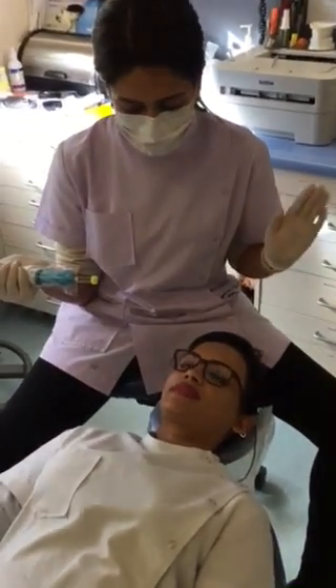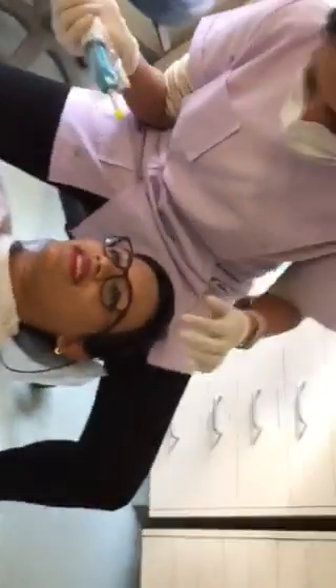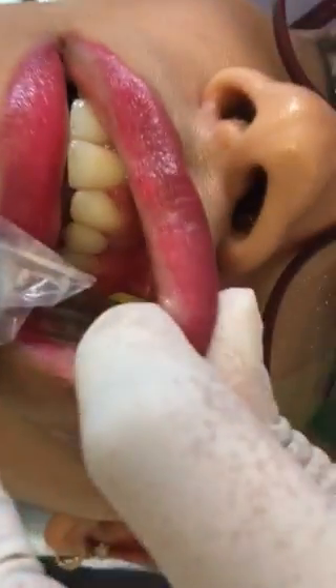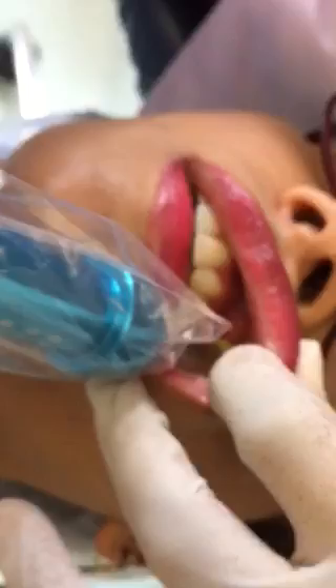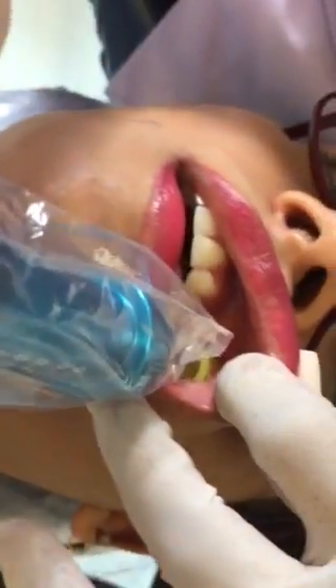Me and Dr. Chitra are performing an infiltration. Hi ladies, okay go for it. So you're performing on tooth number twenty-five. Just apply a bit of pressure. Is that okay with your patient? Yeah, aim it a bit away — just like where you put your normal syringe needle, a bit away, meaning exactly where you put your needle. Yeah, there. Okay, is my phone in your way? Can you see what you're doing? Yeah, I can see what I'm doing.